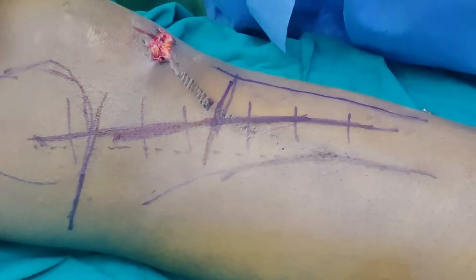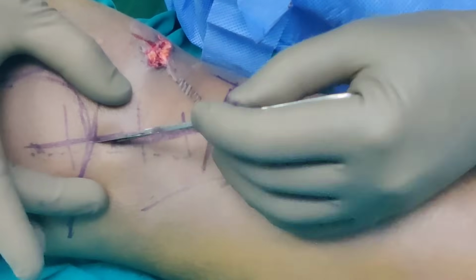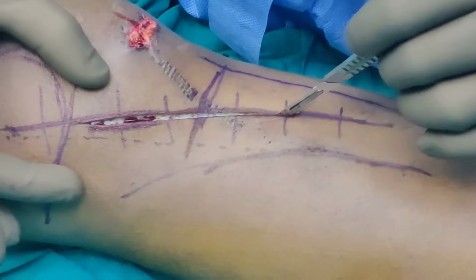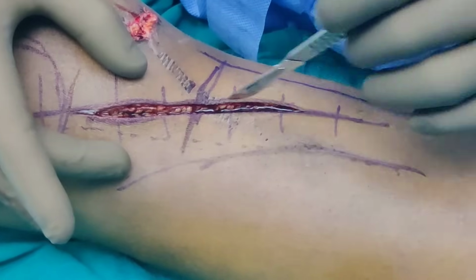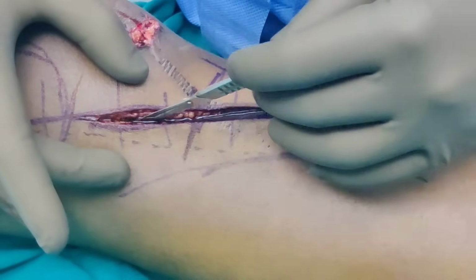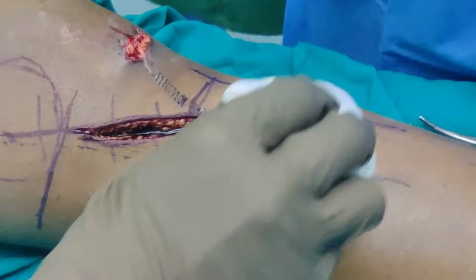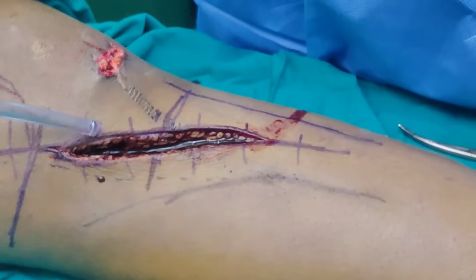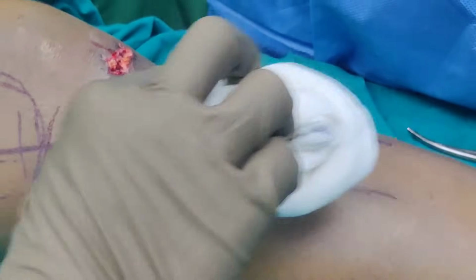So the tourniquet is inflated. Yes, okay. So let's start. I'm not planning to open the joint, so just stay close. Now there are two important structures which can be injured in this approach, the saphenous nerve and the saphenous vein. So I'm just going to put in my self-retaining retractor, achieve some hemostasis, and then I will join you.